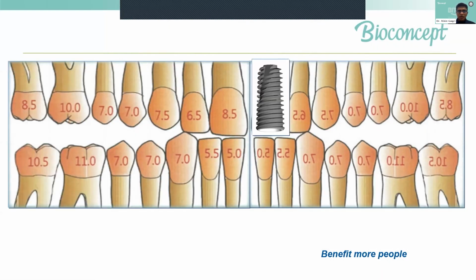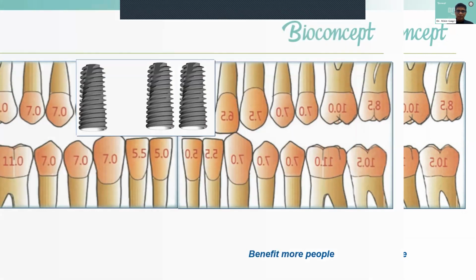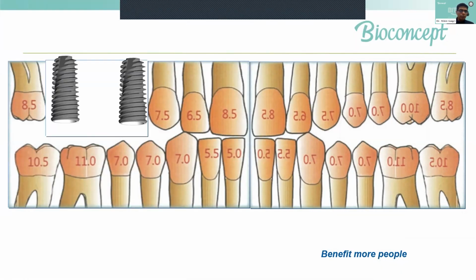How to place your implants in case of more than one or two missing teeth or three missing teeth. This is how you can do a bridge work, which is on similar lines like you would do for natural teeth. You might need one or two abutments. If it's a long span, then maybe three abutments to ensure that the forces are well divided. For posteriors, you can have up to one tooth missing and two implants. If you have three teeth, you need two implants minimum.